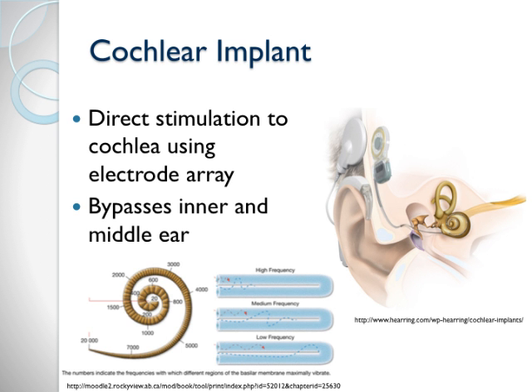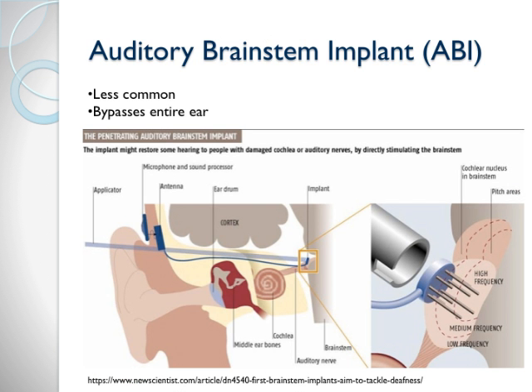Electrodes for cochlear implants is another topic to be presented by another classmate, so we'll move on to the last topic of auditory brainstem implants. A less common and very intricate procedure of today to treat deafness is an auditory brainstem implant. There are many ways the nerve fibers from the cochlea to the brain can be damaged. For example, the removal of a tumor nearby may require partial or even full removal of the auditory nerve bundle.